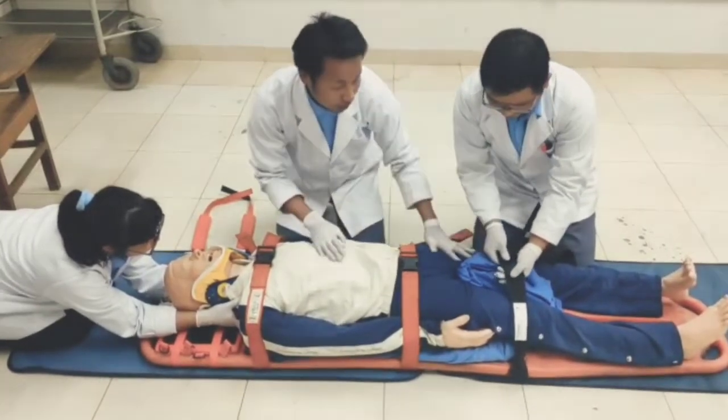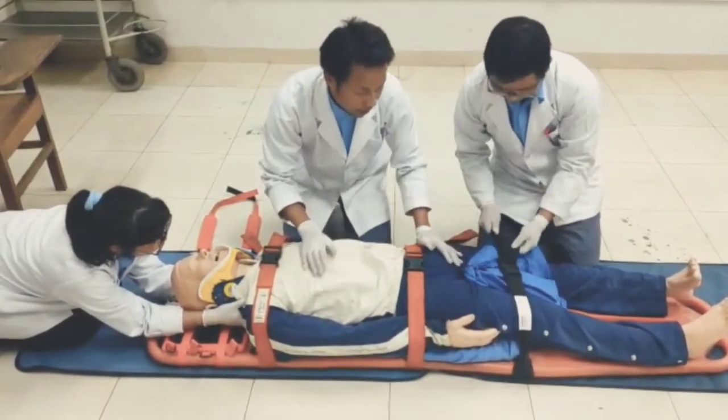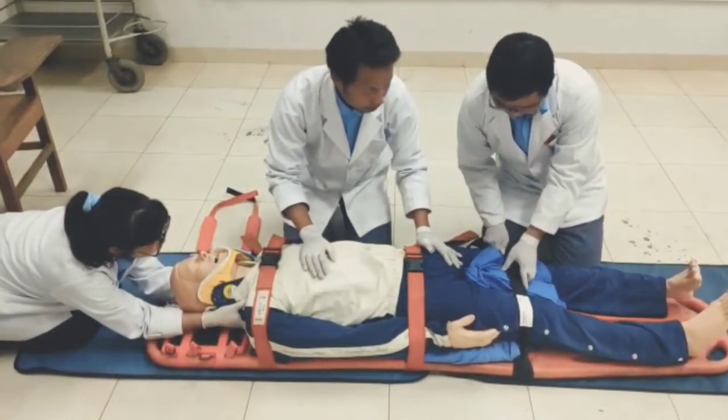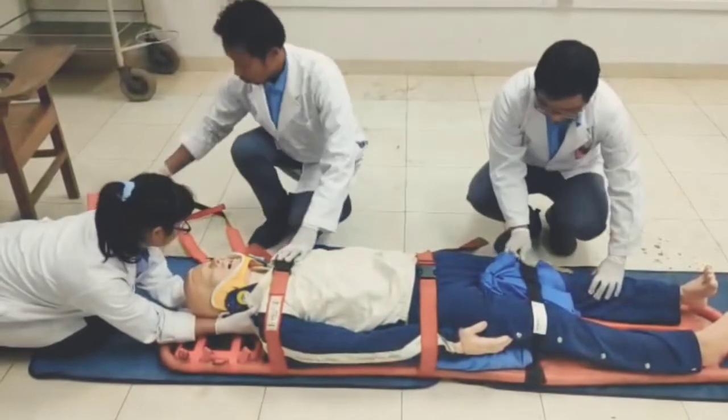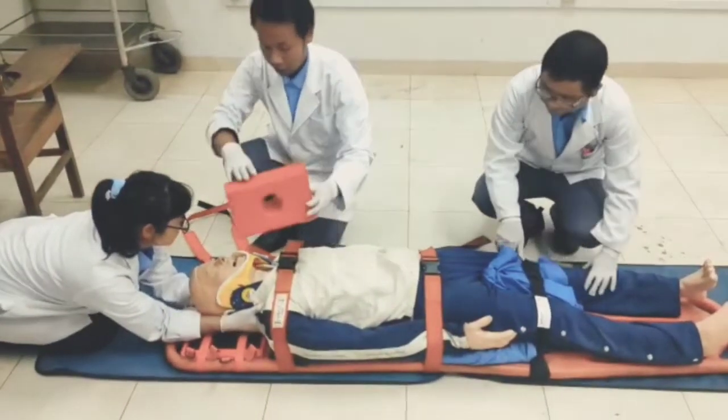Third, we will secure at the lower extremities. Lastly, we will secure at the head side.